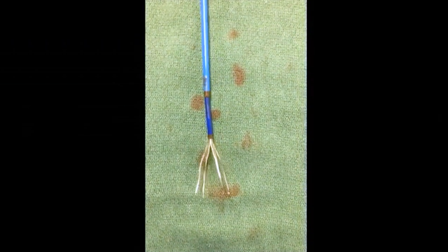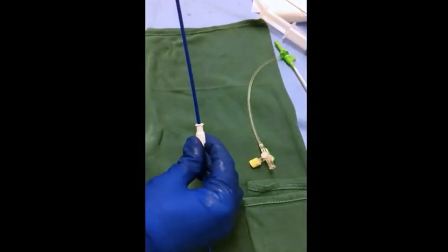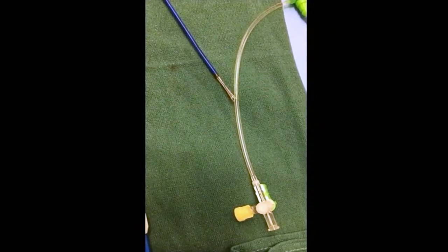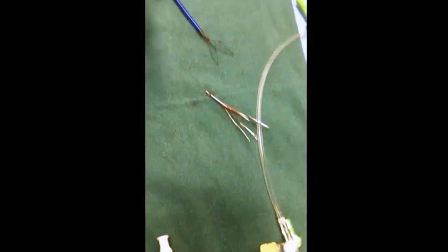Advancing the 8 French sheath captures the IVC filter, and the inner sheath is then pulled out from the outer sheath, leaving the 10 French sheath in place with the filter removed from the body. Finally, the filter is inspected to ensure that all pieces of the filter were removed intact.